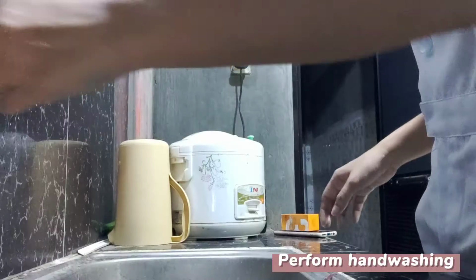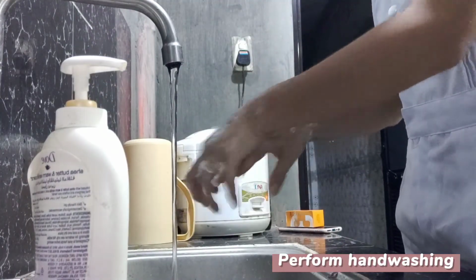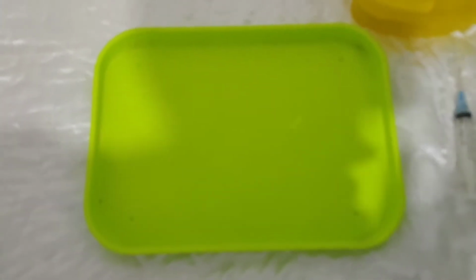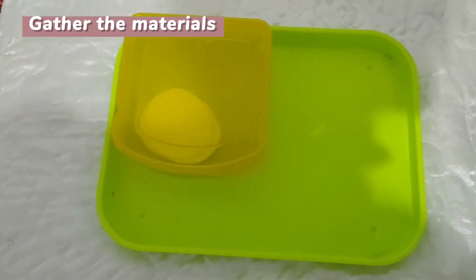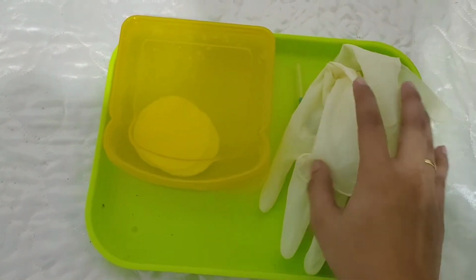Next I am going to wash my hands. Now we will gather the materials that we need for the preparation: alcohol swab, a syringe, and gloves.